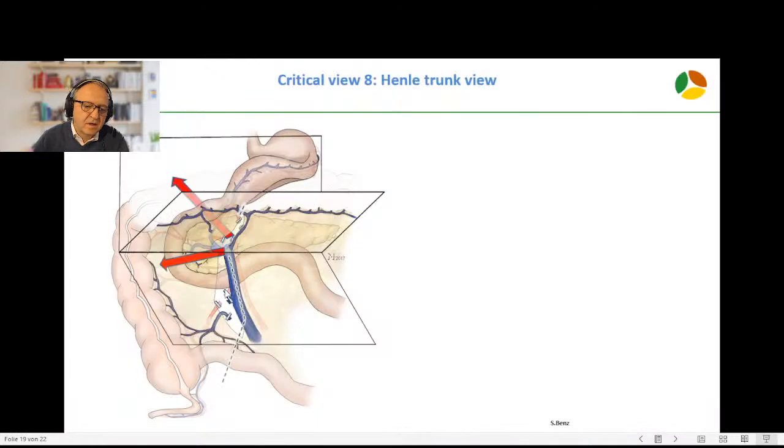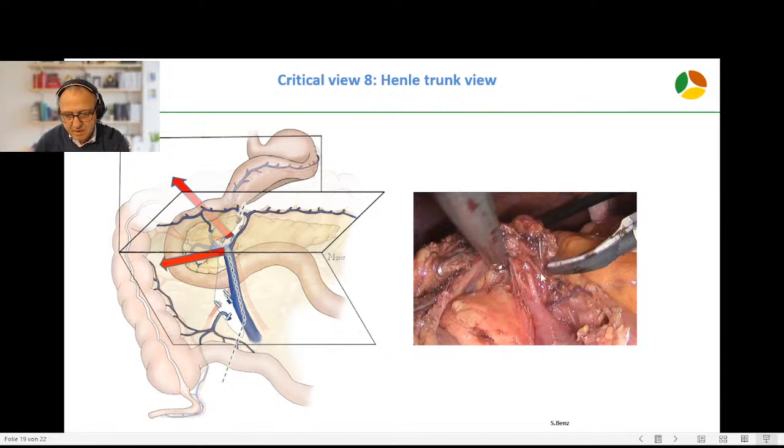The last step of central dissection is the dissection of the Henle trunk. The strategy here is to stay on the anterior side of the SMV looking for the Henle trunk and staying anteriorly. Then you can divide all veins running into the Henle trunk from anteriorly. This will be critical view number 8: SMV here, Henle trunk, and here the first vein from anteriorly running into it that can later be divided.